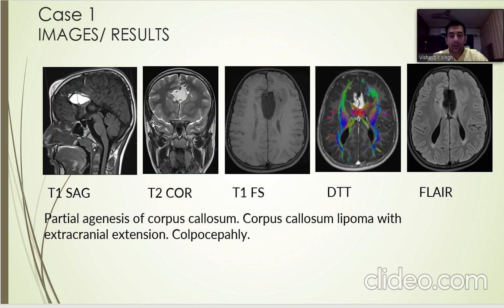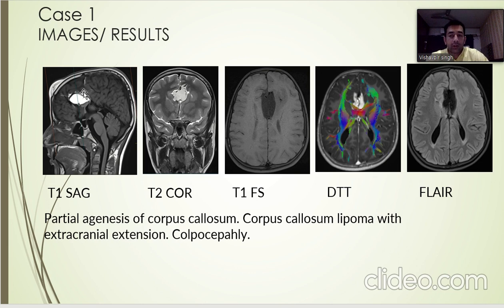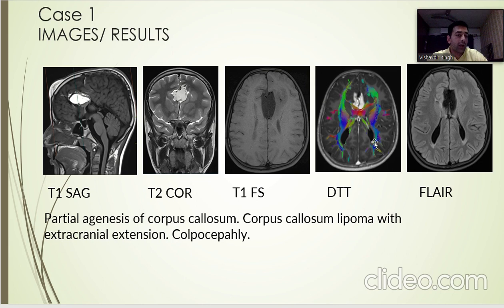Starting with my first case, on T1 sagittal section we see a well-defined lesion in the frontal area. This appears T1 hyperintense, T2 hyperintense, and appears hypointense on T1 fat-sat.